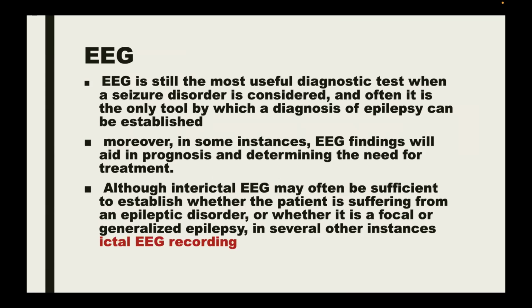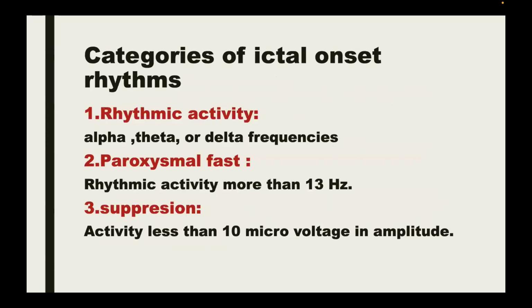So EEG is still a useful diagnostic tool in seizure disorders. Often it is the tool by which the diagnosis can be established. Even in our country, EEG has significant work in the diagnosis of epilepsy. However, EEG findings will also determine treatment. So we will perform ictal EEG recording. We have categories for focal ictal EEG recording.